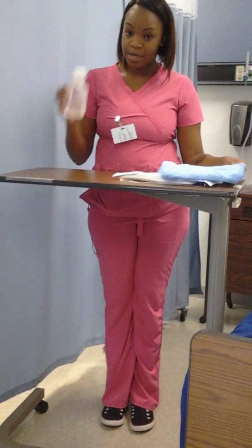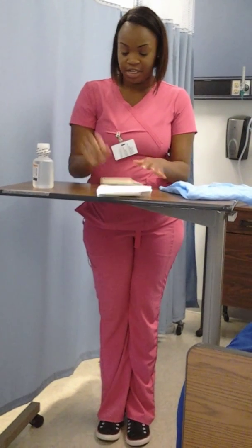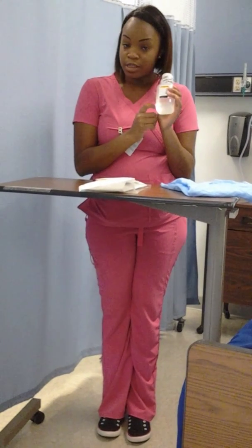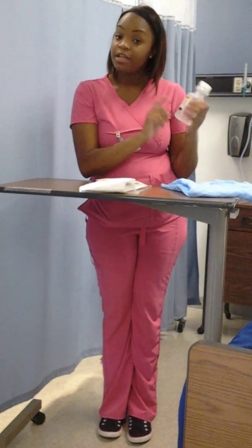I have all of my equipment. I have an extra set of sterile gloves just in case I need them. I have the nasal suctioning kit, and I have some saline. The normal saline, it's never been opened. It's brand new. I checked the expiration date. It has not been expired, so it can be used.